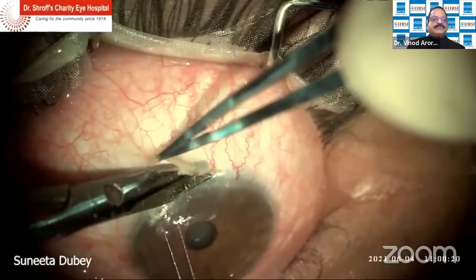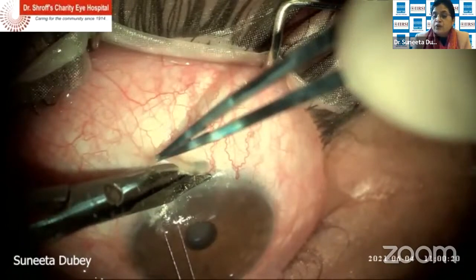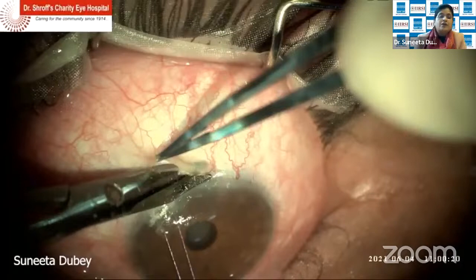Talking about the traction suture, whether it is the corneal traction suture or superior rectus traction suture or no suture, just the self-retaining speculum, or some people use that rotational grip wherein you just grab the posterior tenons and sclera and rotate the eye inferiorly. So I would like to know what kind of traction suture are you using? I prefer this traction corneal suture.